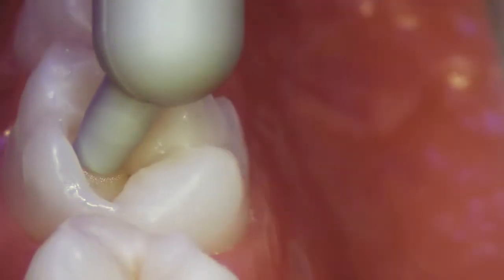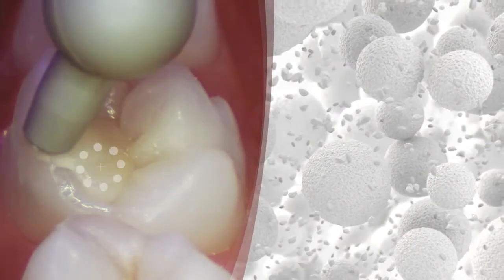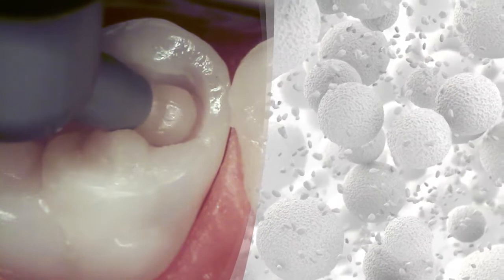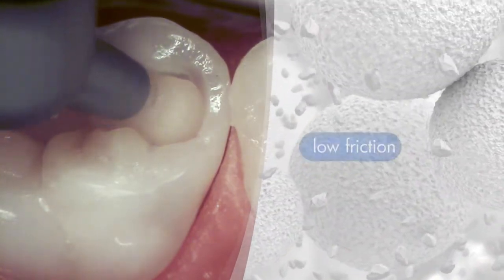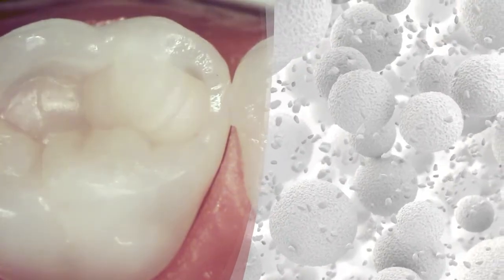You can already feel the difference while extruding the new Ceramax. The spherical fillers of SphereTech provide easy, low-friction application, as well as an unmatched adaptation to the cavity.